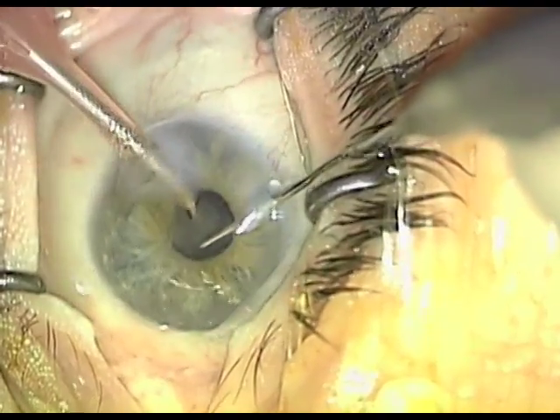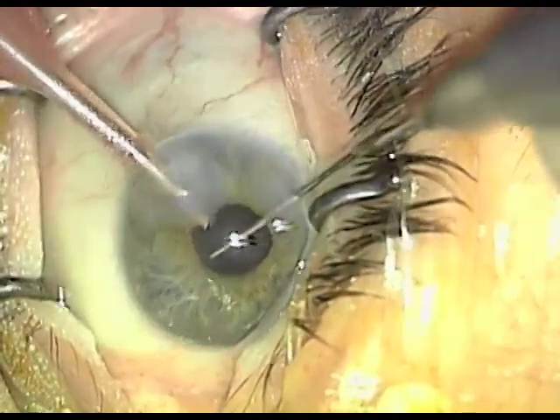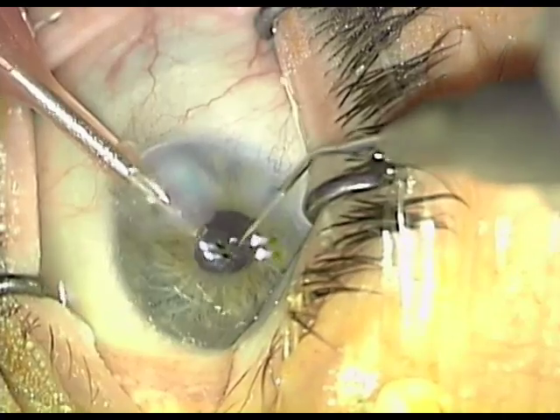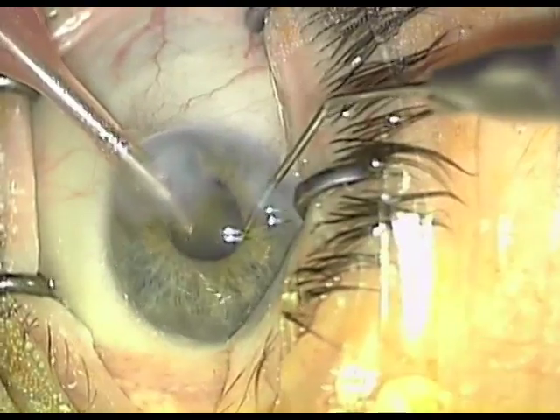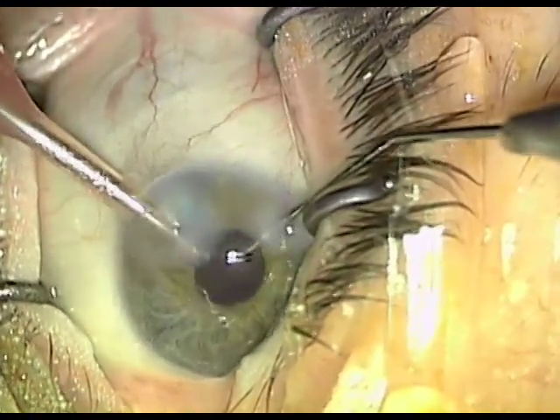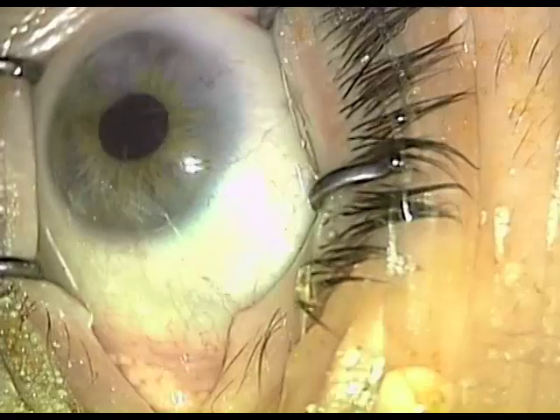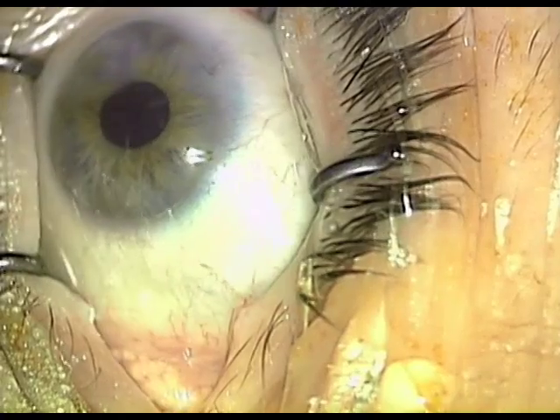This is a 2.2 millimeter technique. We also have the soft tip of phaco to be able to remove any cortex that remains. Sometimes it can be difficult to get access to these pieces and the second instrument does help by teasing the fragment to the proper position so it can be properly delivered and aspirated in the iris plane. Be careful not to leave any pieces behind. Good exploration with the second instrument is important.